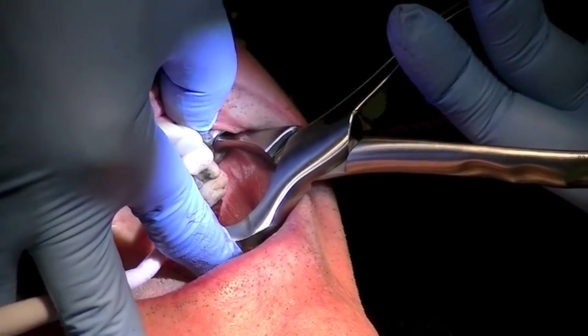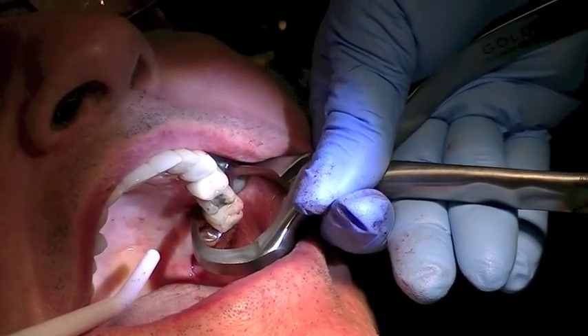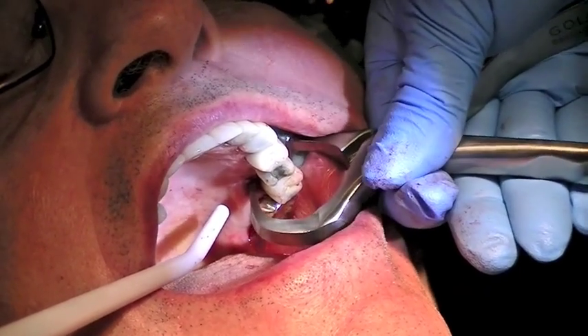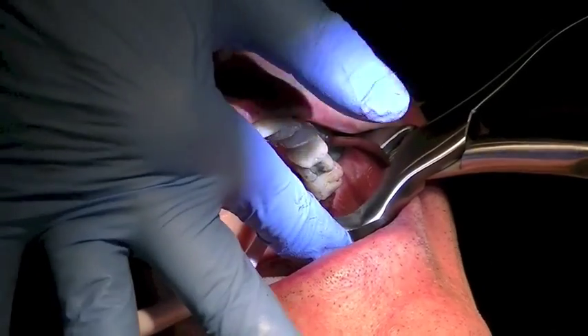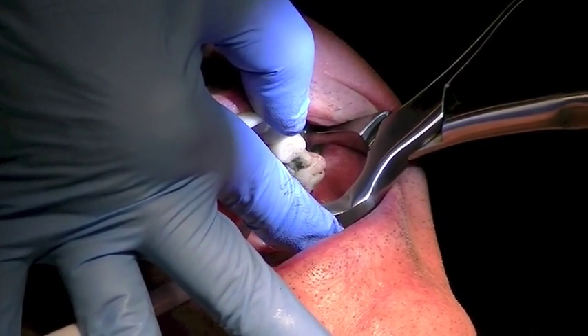And so if you need to take a break and walk away, that's fine. I just want to take my time because I know this tooth has had an old root canal with silver points and I don't want a fracture. Here you see the tooth popping.